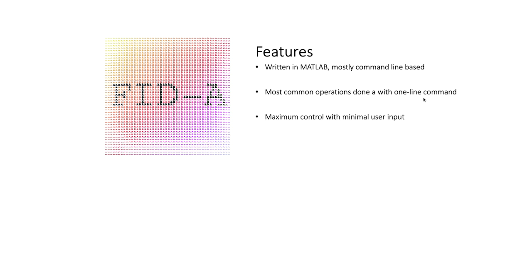A few words about the features of FID-A. So it's written in MATLAB and mostly command line based. Most common spectroscopy processing operations can be done with a one-line command. And this gives you maximum control of your data with minimal user input. The FID-A toolkit is made up of 5 different toolboxes.